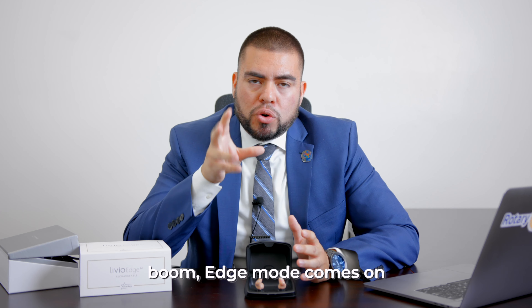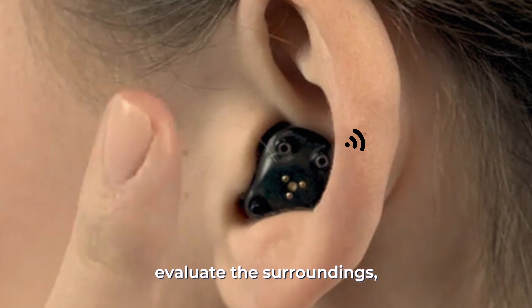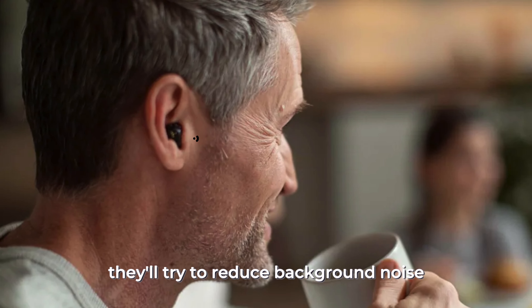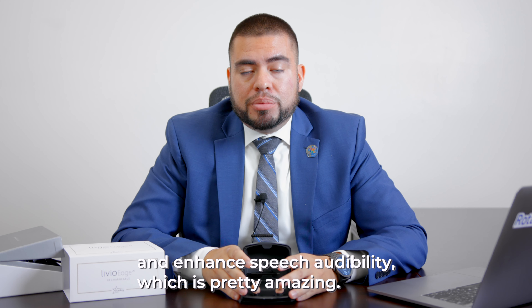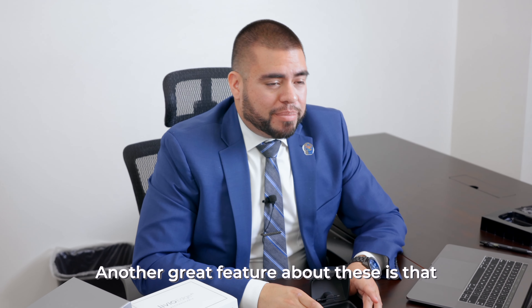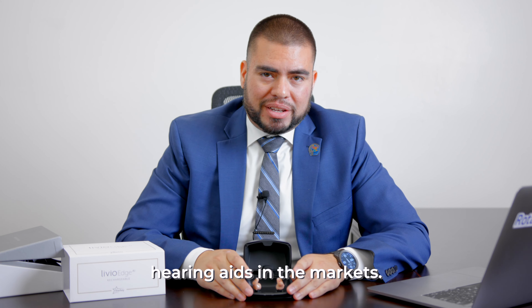you just double tap, Edge Mode comes on, and the artificial intelligence will evaluate the surroundings. If there's a lot of noise, it'll try to reduce background noise and enhance speech audibility, which is pretty amazing. Another great feature about these is that they are the only custom rechargeable hearing aids in the market.